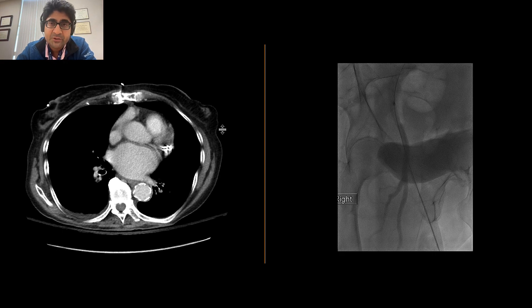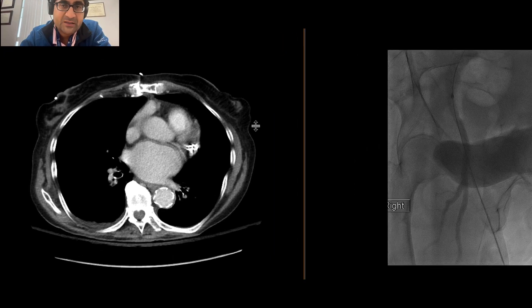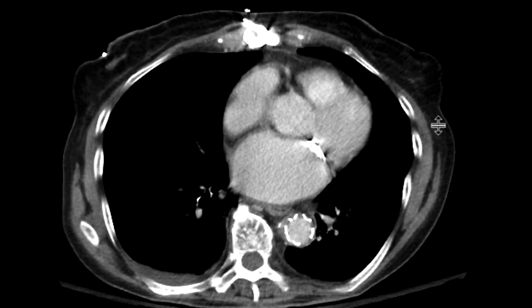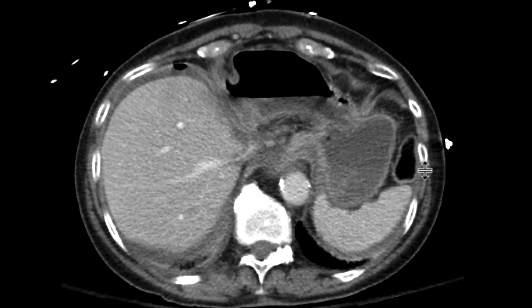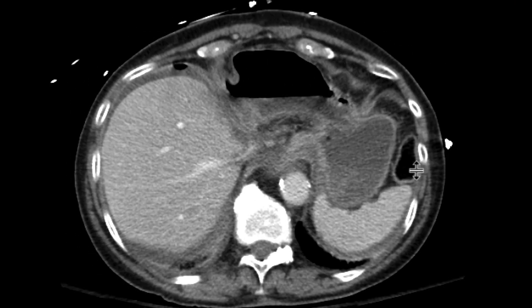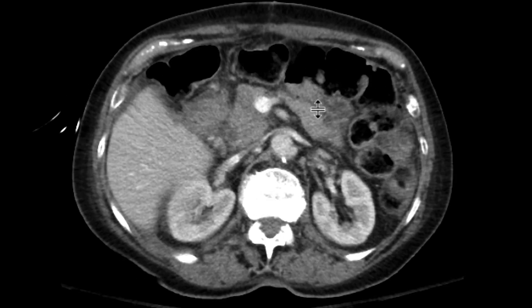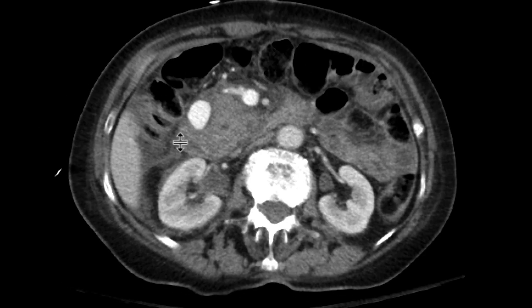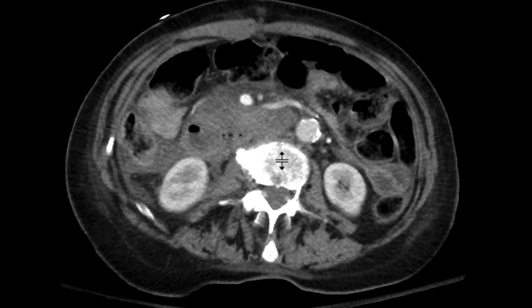This is a patient who came with some abdominal pain, status post left hepatectomy. As we scroll down, we can see those post-hepatectomy changes — some fluids, some free air — but also there's a large contained collection of contrast. We can see it adjacent to the pancreas.